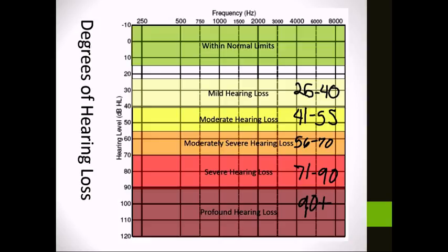Now, the limits of normal hearing are where it starts to break down a little bit. Historically, normal hearing has been from negative 10 to 25 dB. And probably for adults, that's still what you're going to see largely used. For children, normal hearing is really now considered between negative 10 to 15 dB, and the area between 15 and 25 is slight hearing loss.